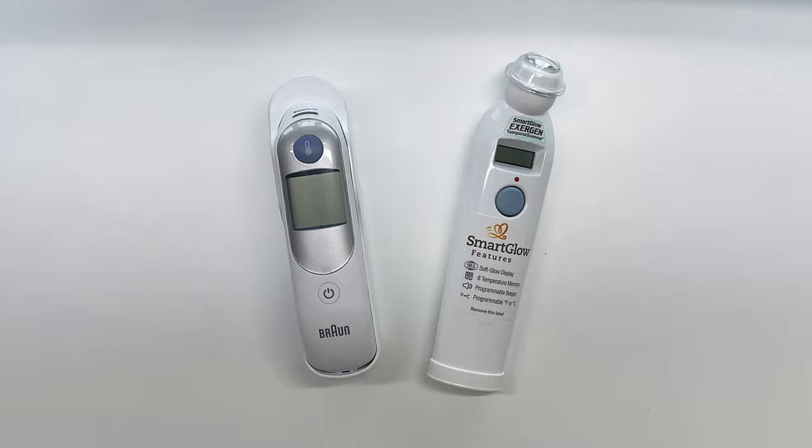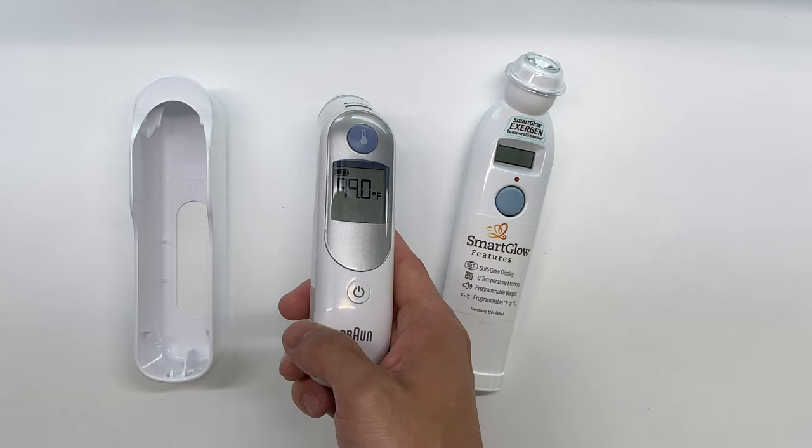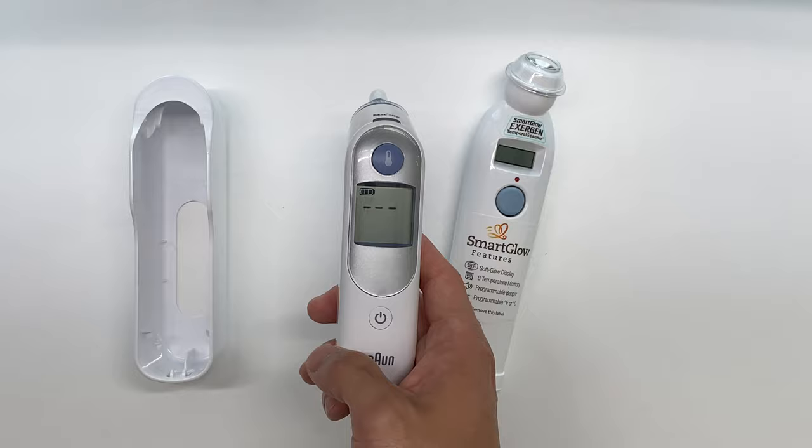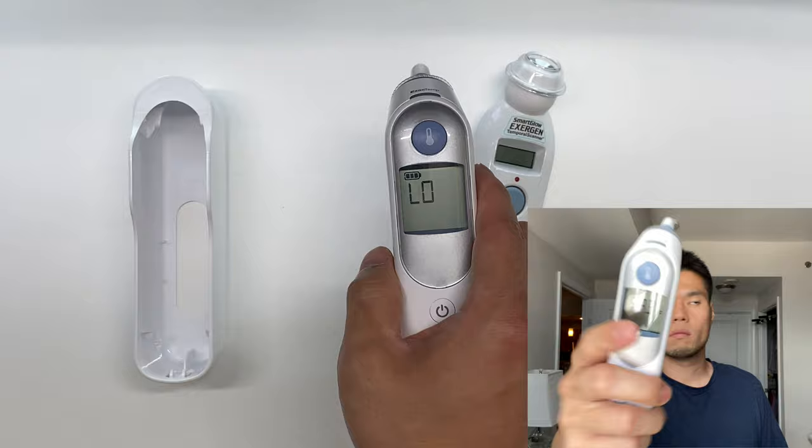We're gonna go ahead and start off with the Braun. The first thing to note about this one is it is an ear thermometer. Taking it out of the casing, we'll go ahead and press the power button. That brings up the last temperature reading we previously had, and to get a new temperature we simply stick this in an ear and then press the measure button, and within a second or two it reads the temperature on the display.